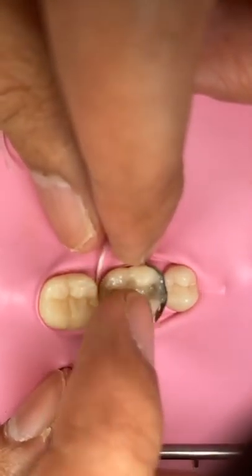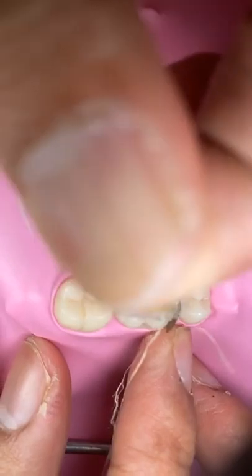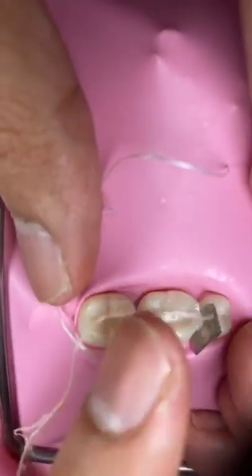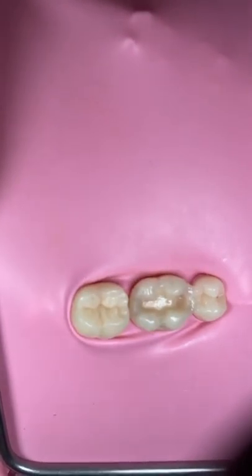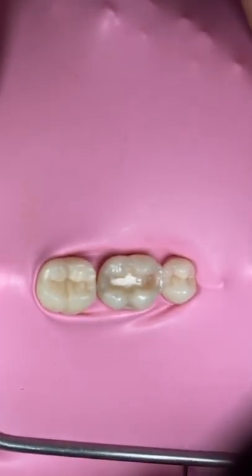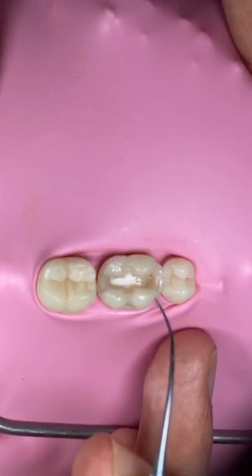Yeah, you will see some excess here. I will show you how to deal with the step here. So basically what you need is your flowable, a little bit of flowable, and then you need to seal all the sharp area, so that when you do the finishing, it will be easier to have a round contact there.